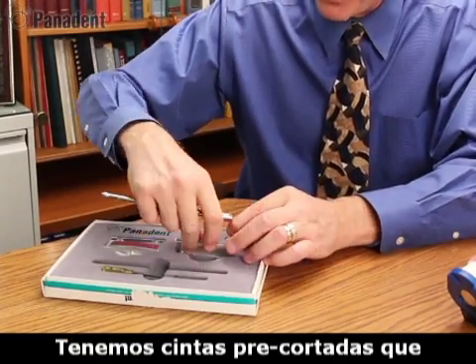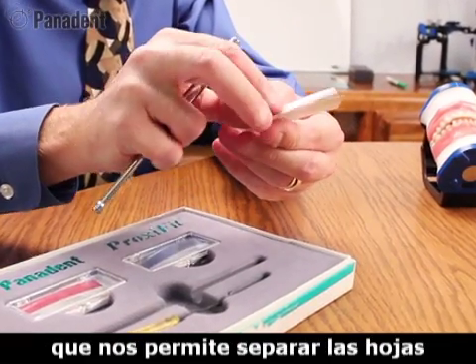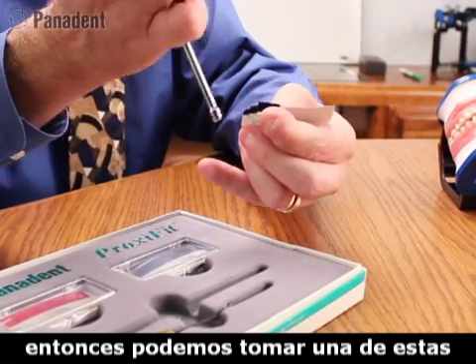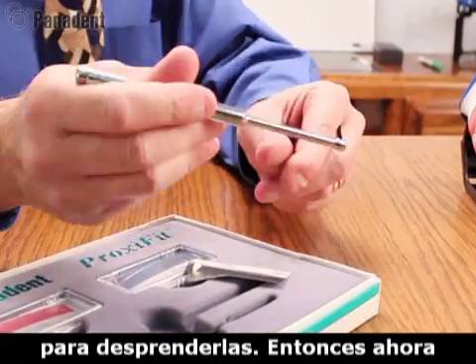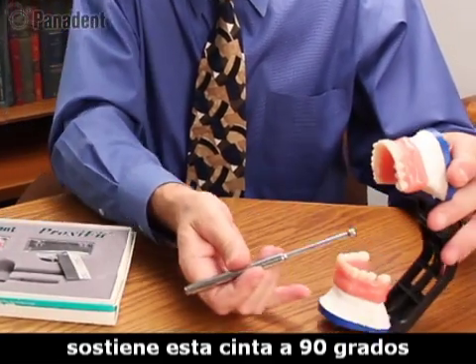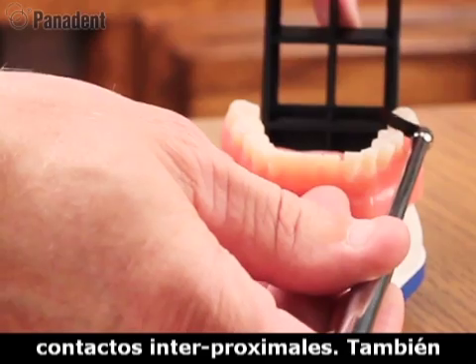We have little pre-cut ribbons and ribbon packets that we can fold over to help separate the clear protective sheet and the paper backing sheet, so that we can grab one of these ribbons with our ribbon forcep and pull it forward. It now holds that ribbon 90 degrees to an interproximal embrasure for marking interproximal contacts.